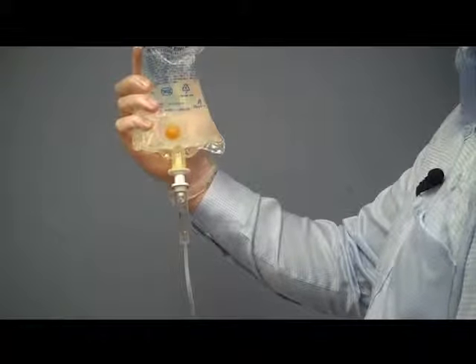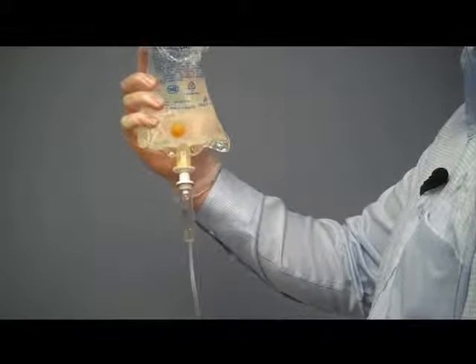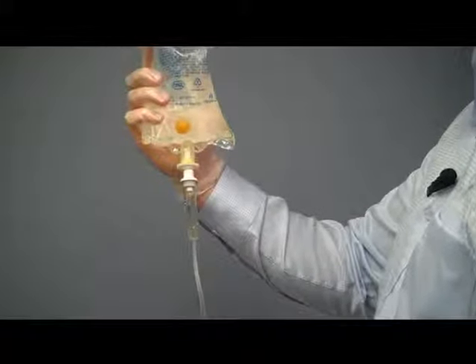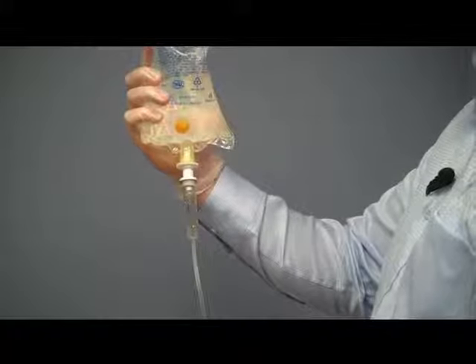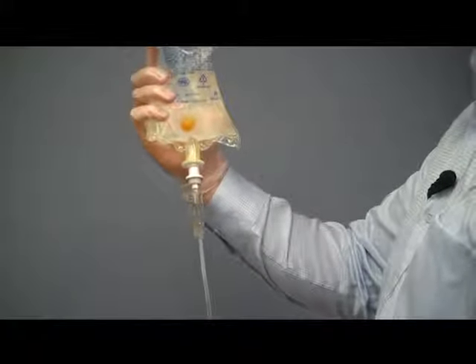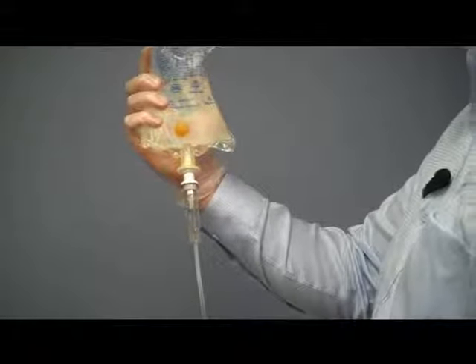Squeeze the drip chamber until it is one third full. Then open the flow regulator and allow fluid to fill the tubing and expel air from the line. Allow the fluid to run until all air and trapped bubbles have been eliminated. Once this is done and the line has been flushed you can close the flow control valve and move on to the next step.